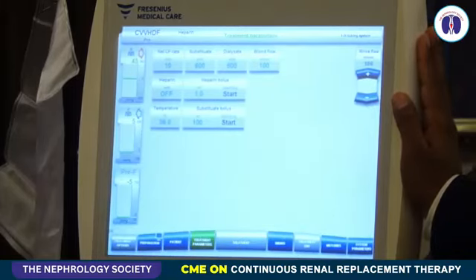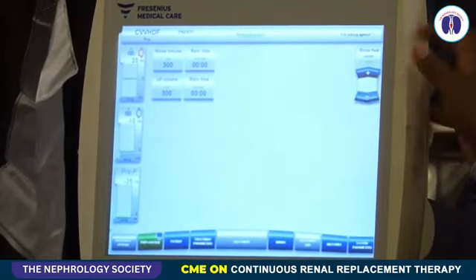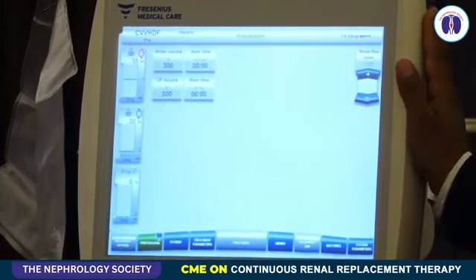That depends upon which phase of sepsis or illness the patient is in, whether the patient is in the resuscitation phase, the stabilization phase, or you want to de-resuscitate the patient. So the fluid goals would depend upon that as well. In somebody who's in the resuscitation phase, you would not be willing to do a lot of ultrafiltration. In someone in the stabilization phase, you just want to replace whatever is being given. For de-resuscitation, you would aim for net ultrafiltration.